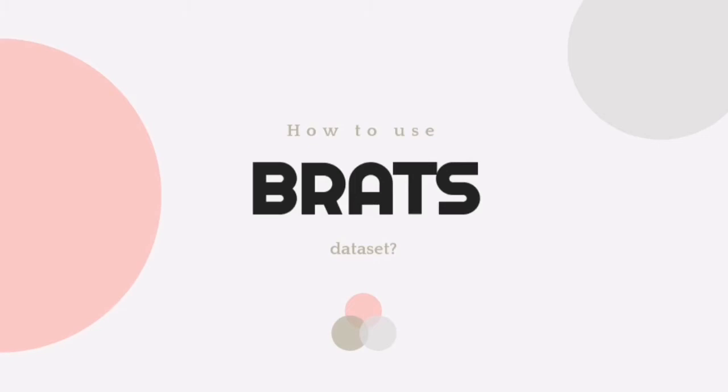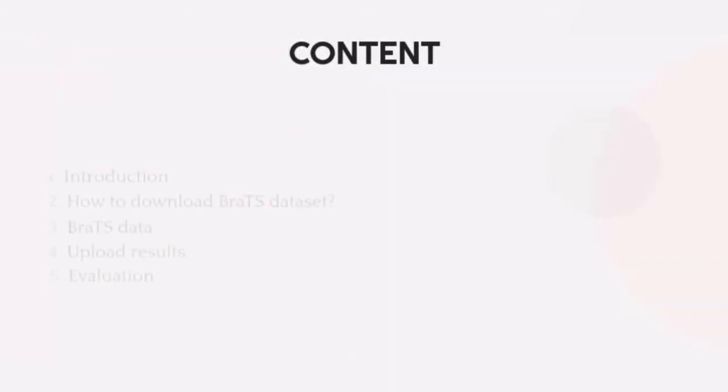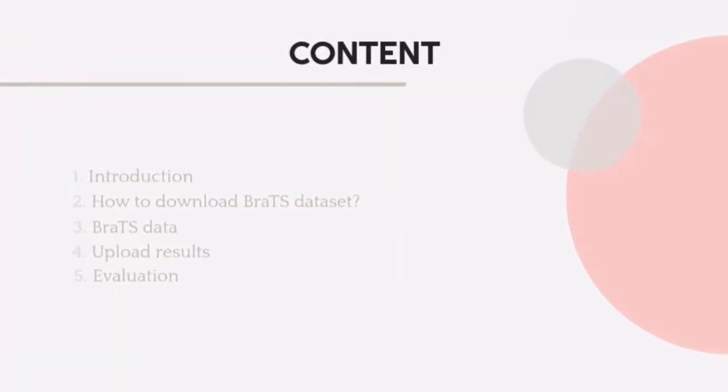So, in this tutorial, I want to show you how to use the BraTS dataset. Before I show you how to access this dataset, I briefly introduce the BraTS challenge. Then I give you more details about its data. Next, I explain how you can upload your results to the BraTS server in order to validate your model. Finally, I tell you about the evaluation metrics which are used in this challenge.